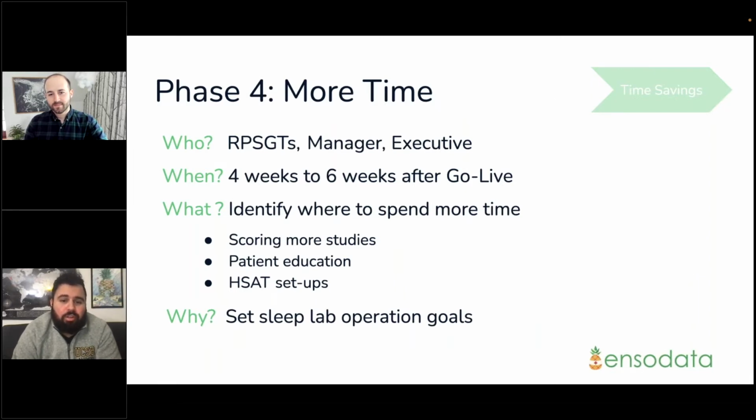So with phase 4, we want to allow you to have more time. So during our conversations, we were able to see that some of the arousals, like I mentioned, were not clinically relevant. So we were able to see that in different studies, there were a lot more severe studies in which the events were a lot more cyclical and that it wasn't really changing the outcome.